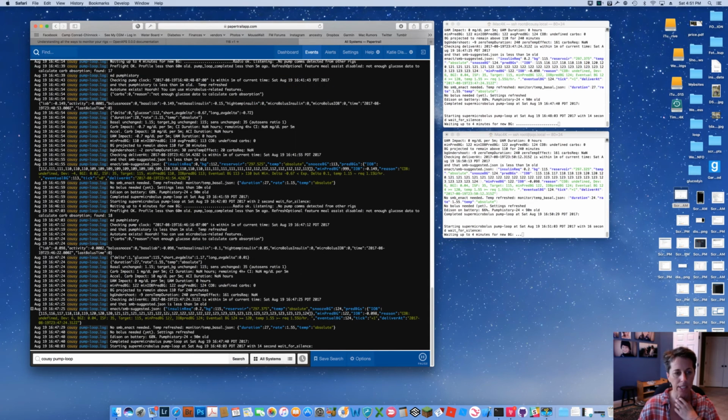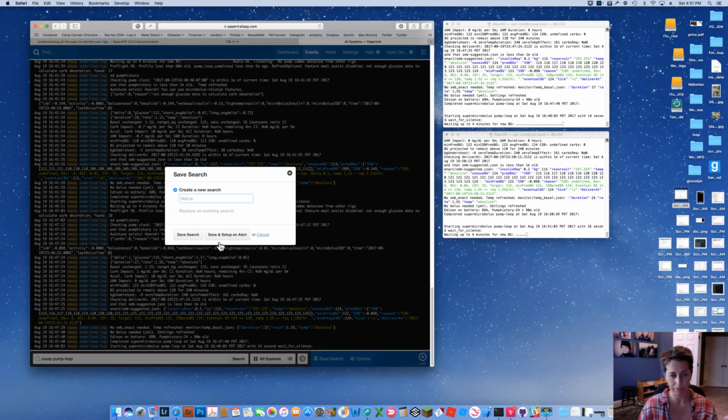And what you'll notice is it automatically search filters for only those lines that are uploaded that include Koozie and pump loop. So that's this. Wow, that's super valuable. If 99% of our information is going to come from looking at the pump loop, this is an important one to save. So you can go ahead and press the Save Search button down here.